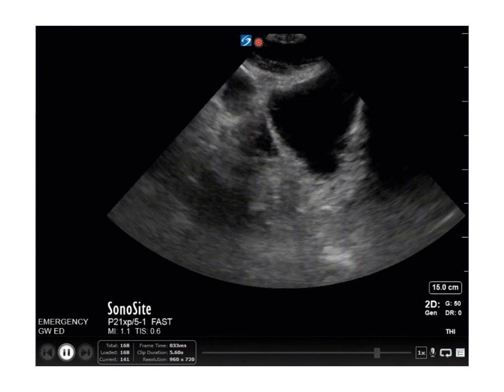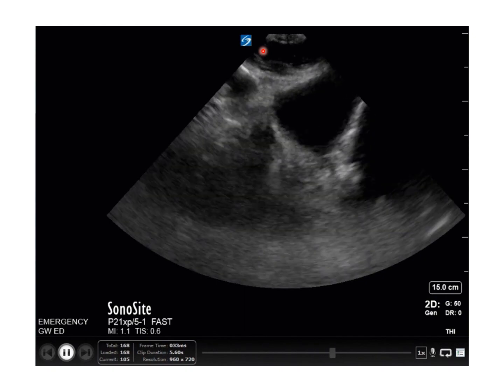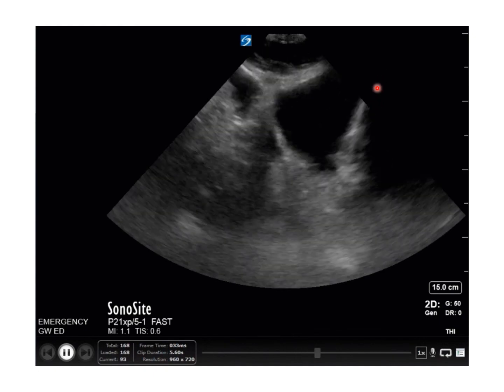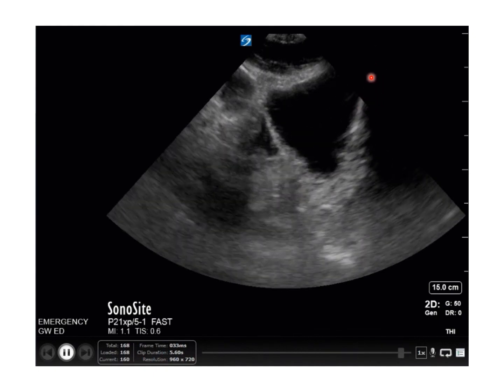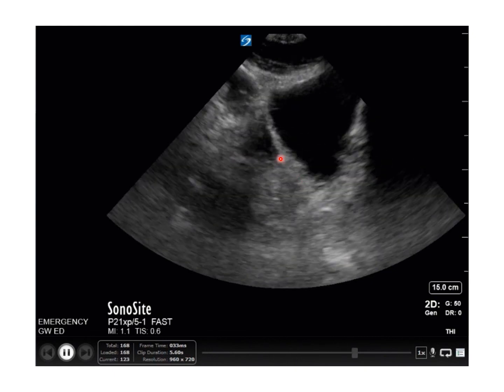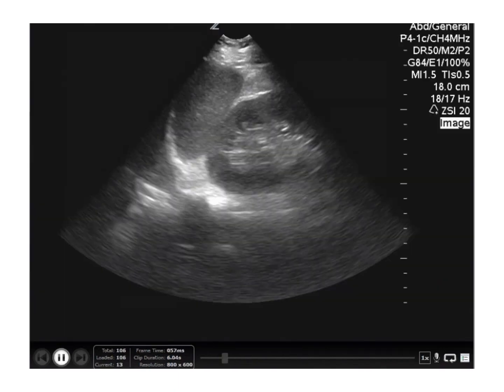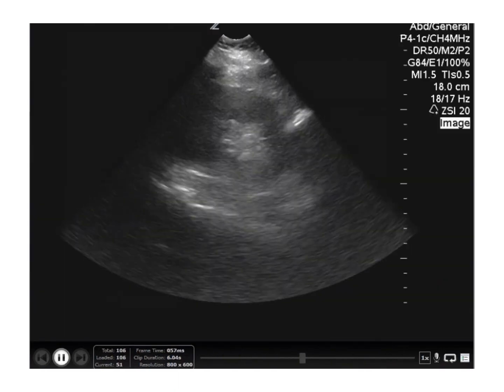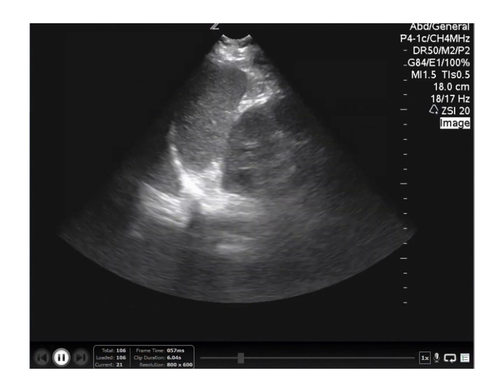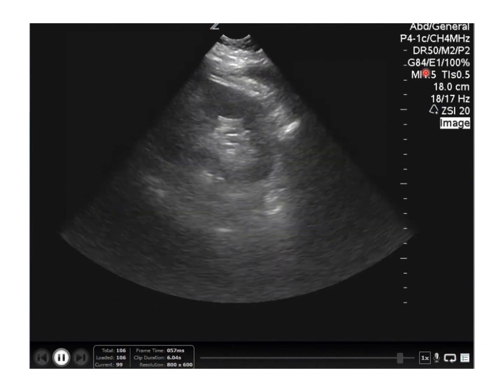And the probe marker is towards the patient's head or towards their right side. It's towards their right side, as you can see the bony rim of the pelvis here. So that's pubic symphysis, bladder, and that's the rectovesicular space here with some free fluid in it. And the quality of these images represents real life scans. They're not always perfect.